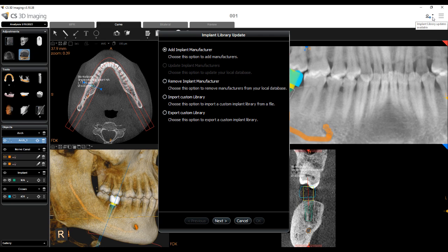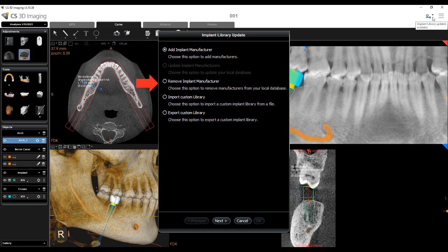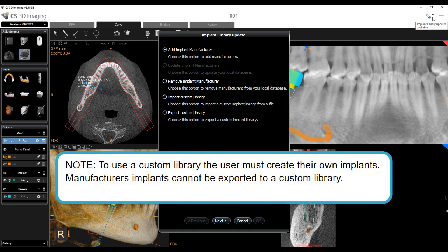The options in the update window are: Add an Implant Manufacturer, Update Implant Manufacturers, Remove an Implant Manufacturer, and Export or Import a Custom Implant Library. Note: to use a custom library, the user must create their own implants. Manufacturers' implants cannot be exported to a custom library.